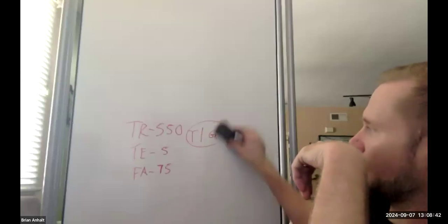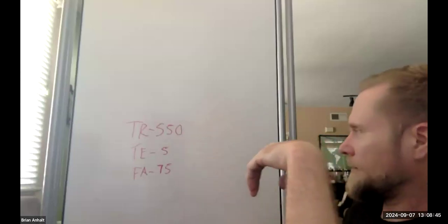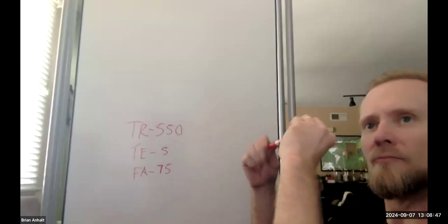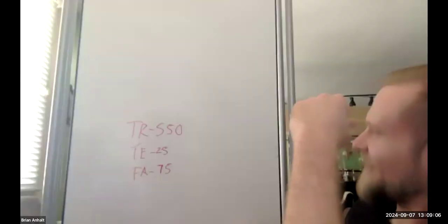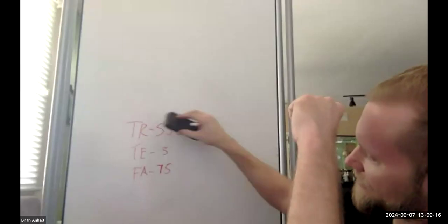That's it right there. How do I make it a proton density weighted gradient echo? The TE. That'll work. What else? Lower flip angle. You want low TE and low flip angle.